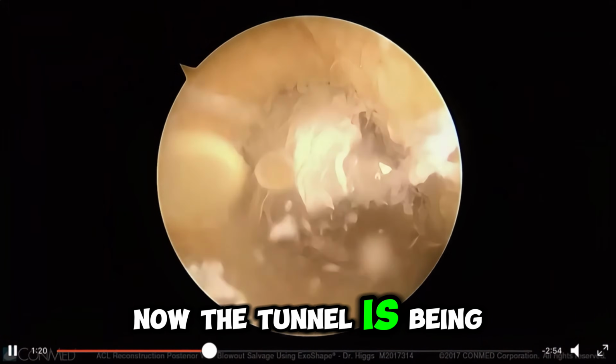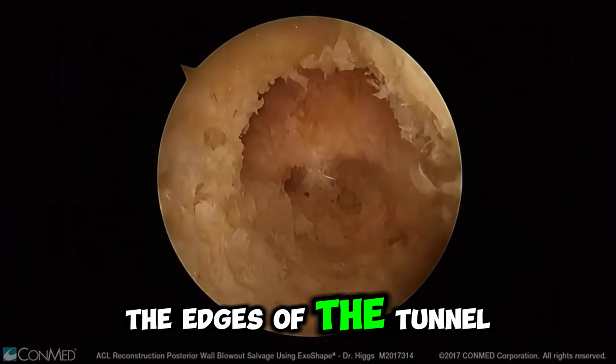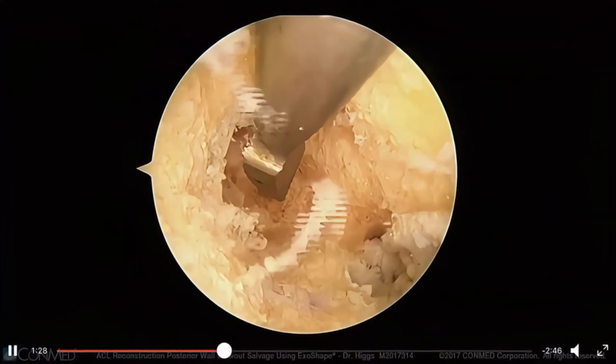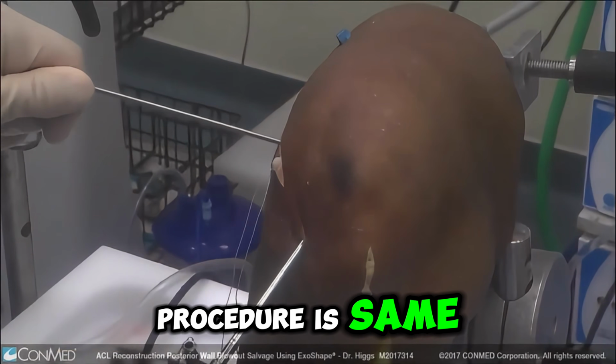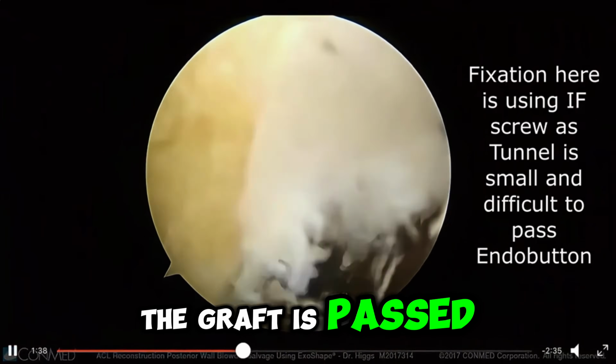Now the tunnel is being drilled, and then the edges of the tunnel are smoothened with the rasp, as you can see here. And the rest of the procedure is the same. The threads are withdrawn and the graft is passed.